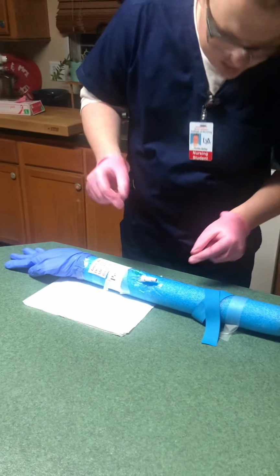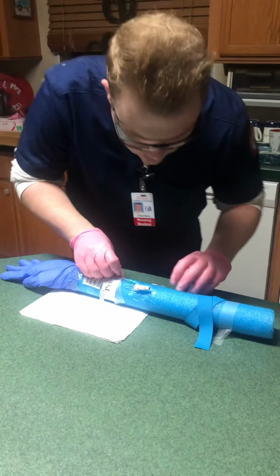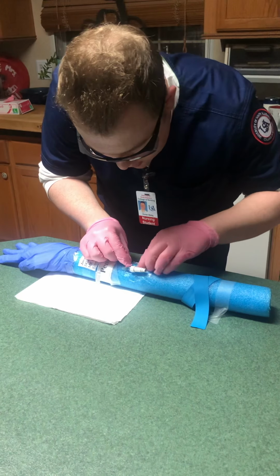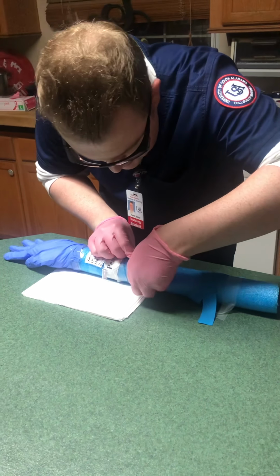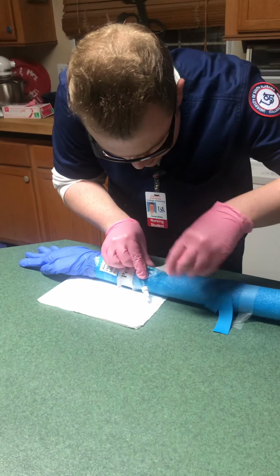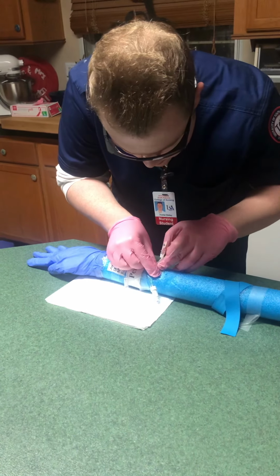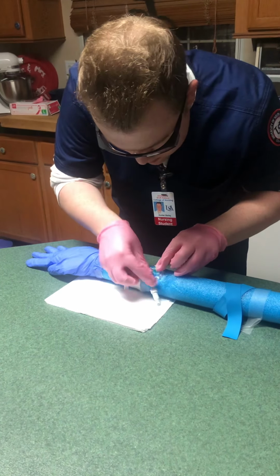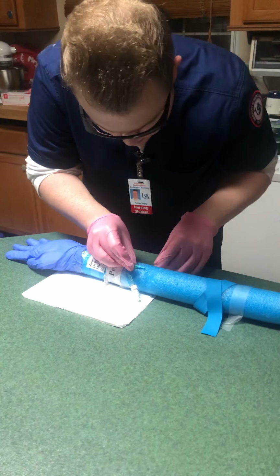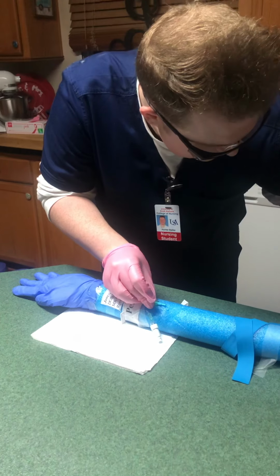So the first step that I'm going to do is move the Tegaderm in while I'm stabilizing the catheter, and I'm moving it in from all positions towards the catheter. It's not wanting to come off.